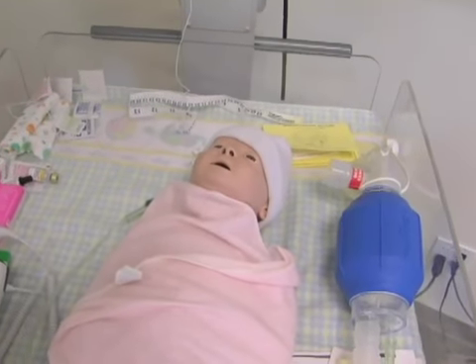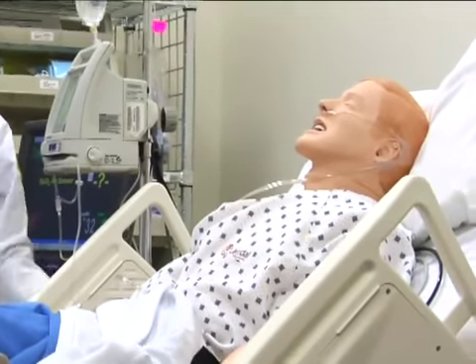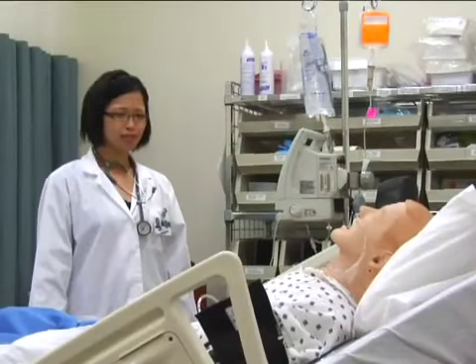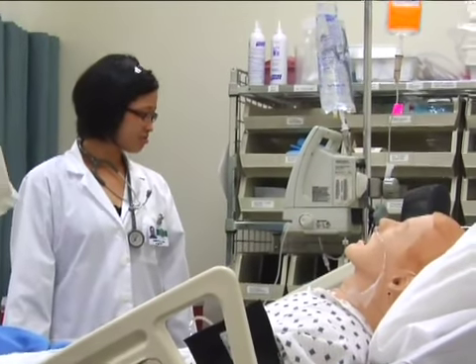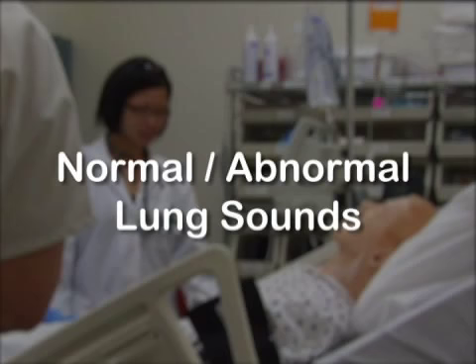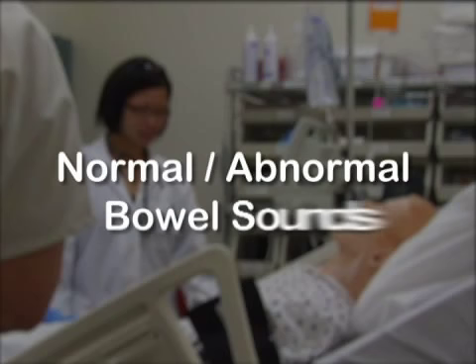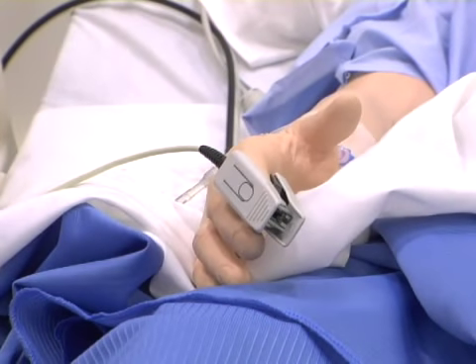The baby Sim can cry. The mannequin, or Sim Man, can talk. "Can't breathe and my chest hurts." He can cough, and even vomit. He may ask questions and can respond to your questions. He has many physiologic sounds: heart rate, heart murmurs, normal and abnormal lung sounds, normal and abnormal bowel sounds. You can obtain an oxygen saturation by attaching the probe to his finger.